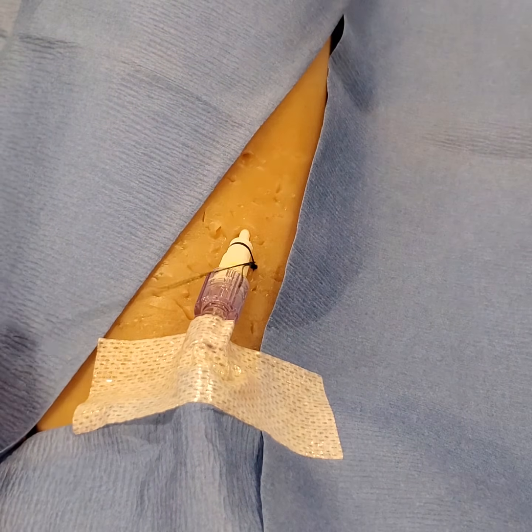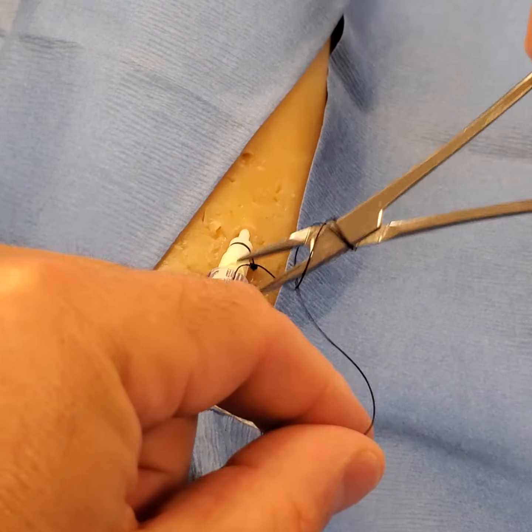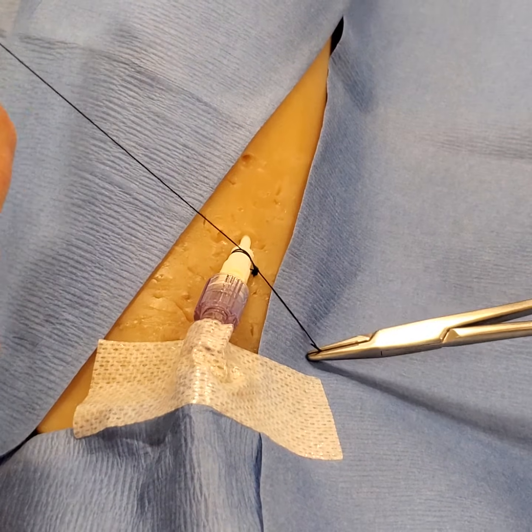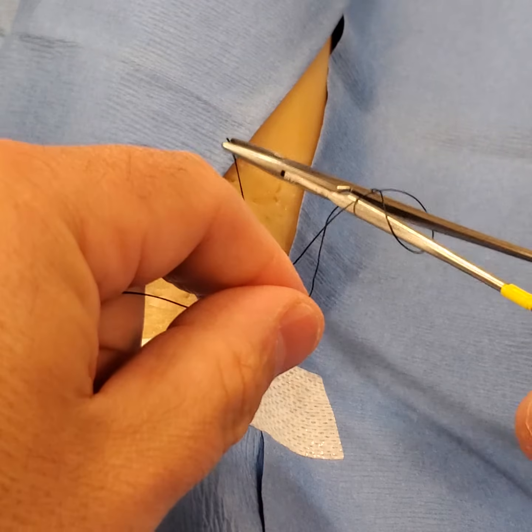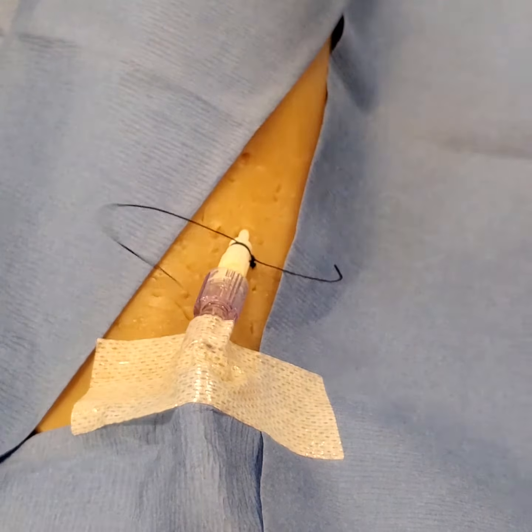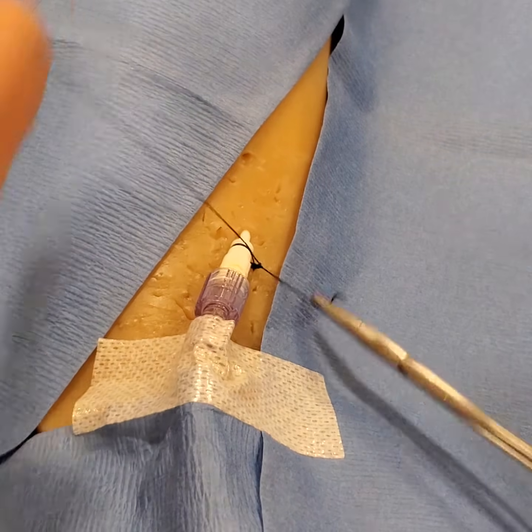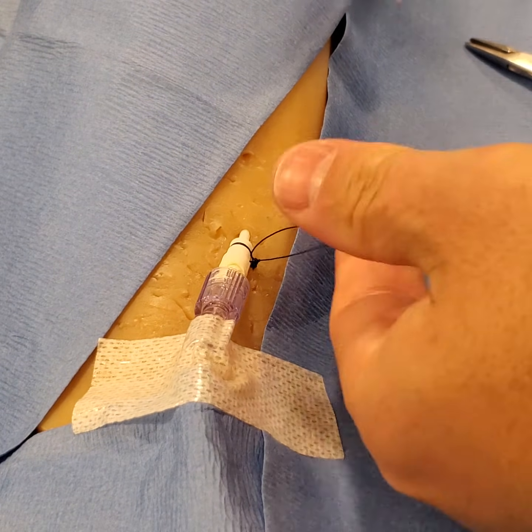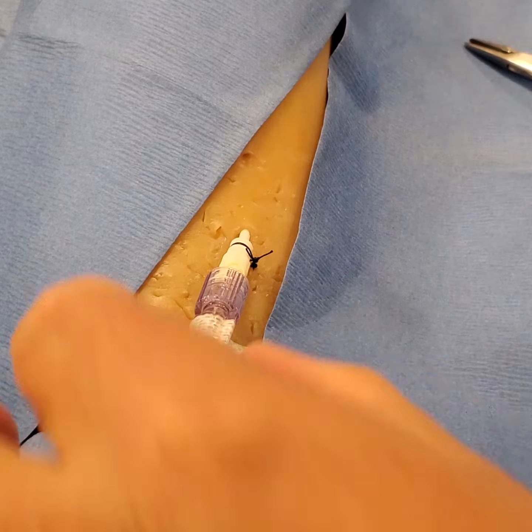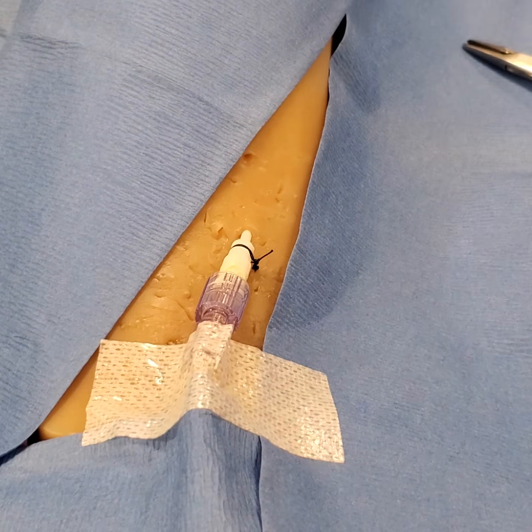Now you would simply tie it off to your original anchor point. Keep the needle driver open, go one, two, three — pull it taut — then one, two, and one, two. Then you can cut it, and you can see it's well anchored to one side and it's not going anywhere.